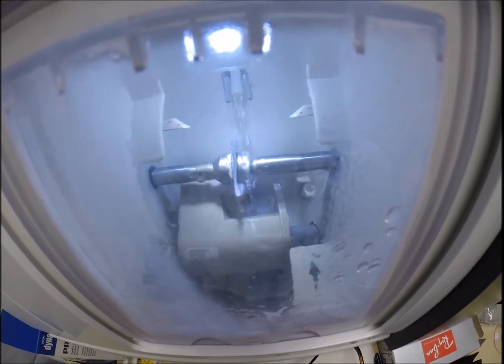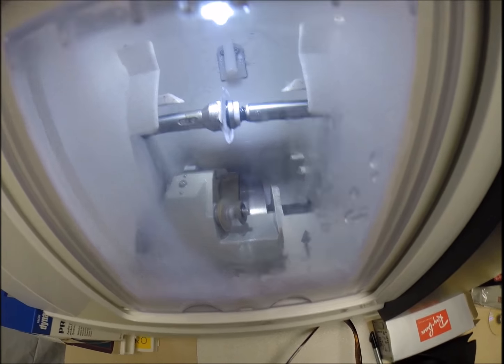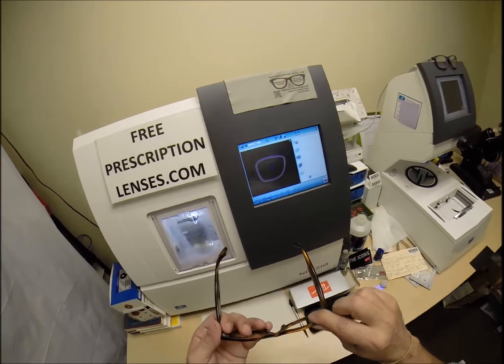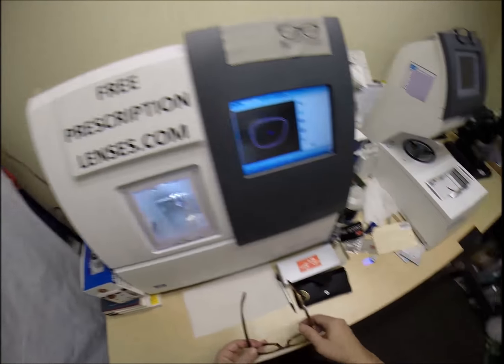So a little lever has come out. It's putting the safety bevel on the rear concave surface of the lens. Should any portion of the lens come through the back of this frame, which it won't, and come into contact with your chin, or cheek, excuse me, it'll be nice and smooth.